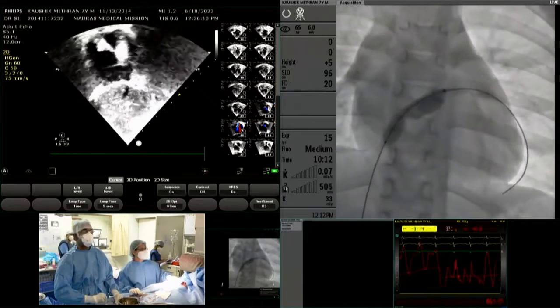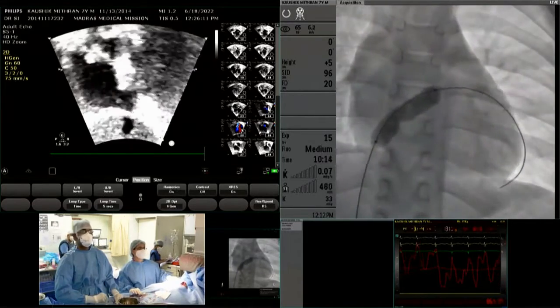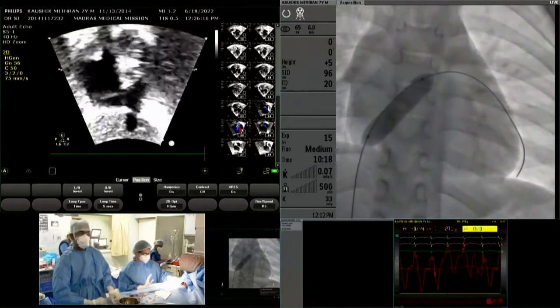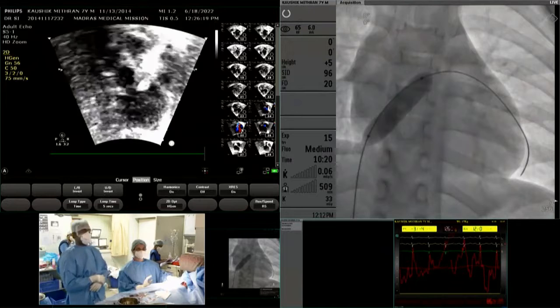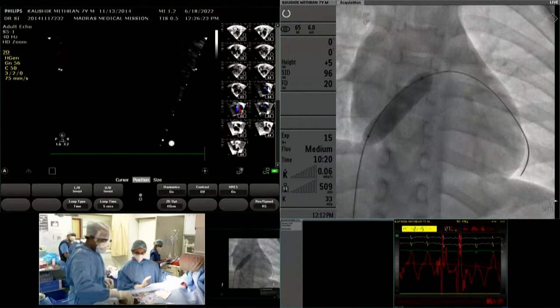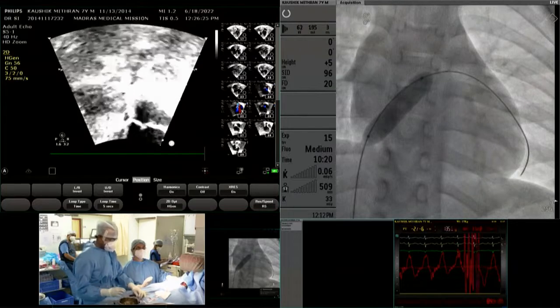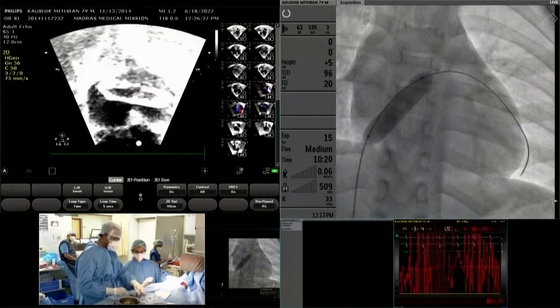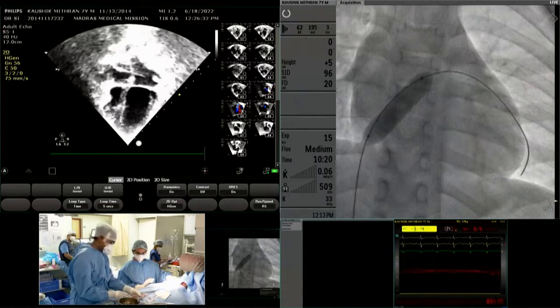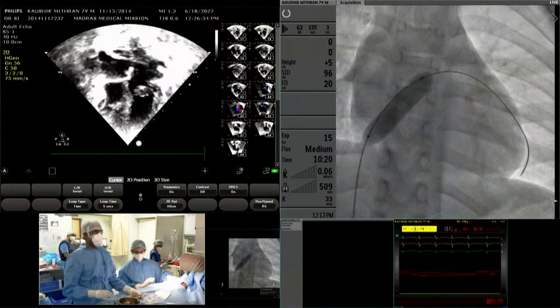Yeah, you are across the so-called wide foramina or small ASD. Now we'll do the bubble contrast. Yes. But now I am less optimistic because I know that there is possibly another orifice through which I had crossed. Now the question will be, we probably have to cross through the second orifice also.